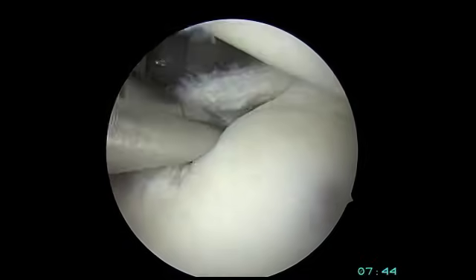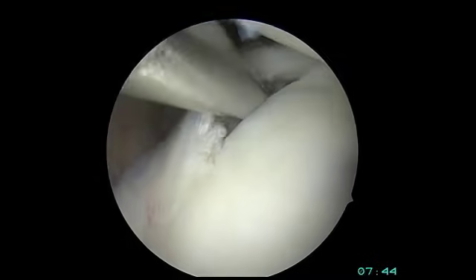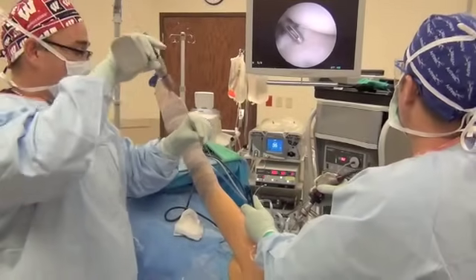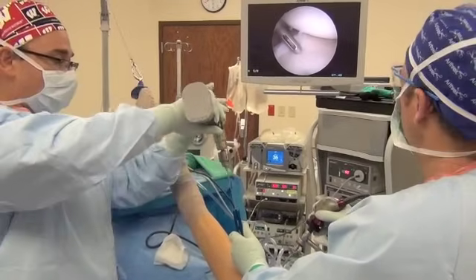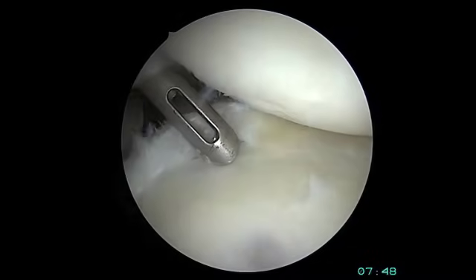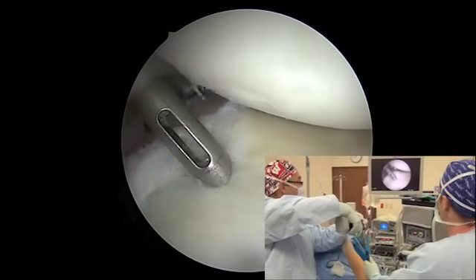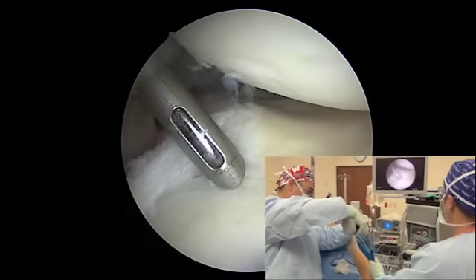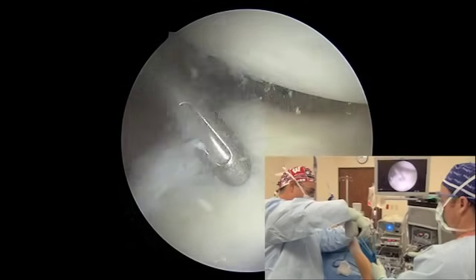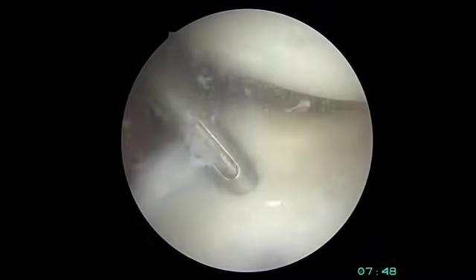You can see how the labrum is detached from the bone. The next step is to place the fixation devices, which are the suture anchors. This is a drill with a guide that will be placed right up on the glenoid rim. The drill bit comes into place and we drill a small pilot hole on the glenoid rim, which will house our suture anchor.